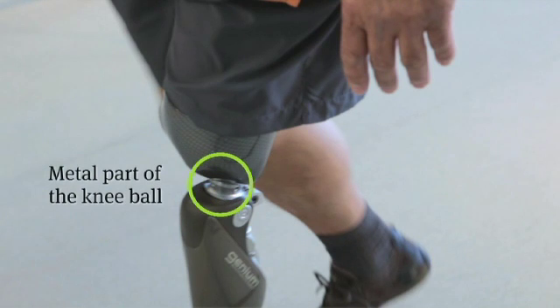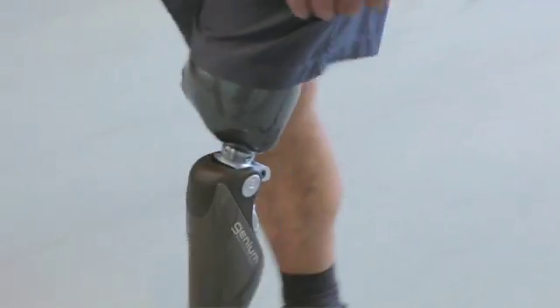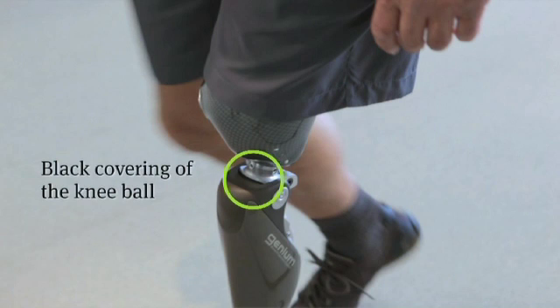Do you see only the metal part of the knee ball? If so, the user is walking with only 4 degrees of flexion. If you see the black covering of the knee ball, the user is walking with an appropriate increased knee flexion.